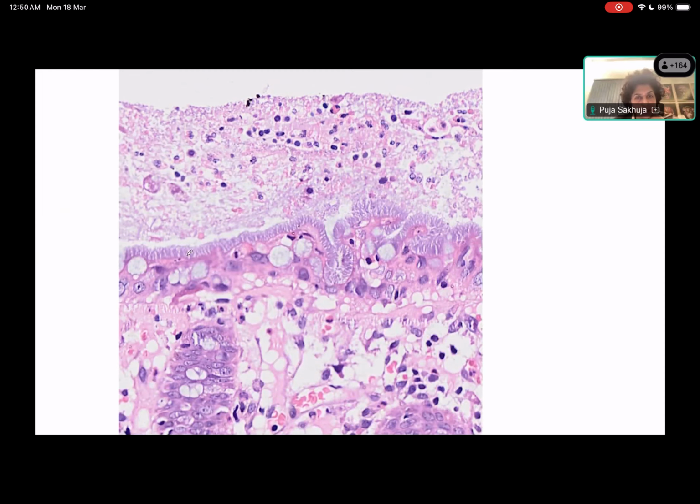Here again, you can see this. And you can see the Entamoeba histolytica also here, the exudate, and this over here, a very nice brush border like structure. Which organism causes this sort of a pattern? Yes, spirochetes. Very good. So spirochetes can cause this sort of a picture. They will come and adhere to the surface of the epithelium, causing this sort of bluish brush border like appearance. And so what should we stain with? A silver stain. Correct, silver stain. But which silver stain do we usually do for this? Warthin-Starry silver stain. Correct. Okay. So for spirochetes, this is another picture in high power.